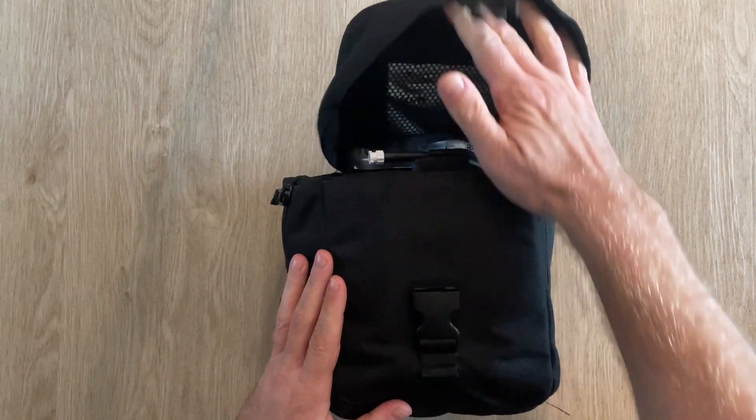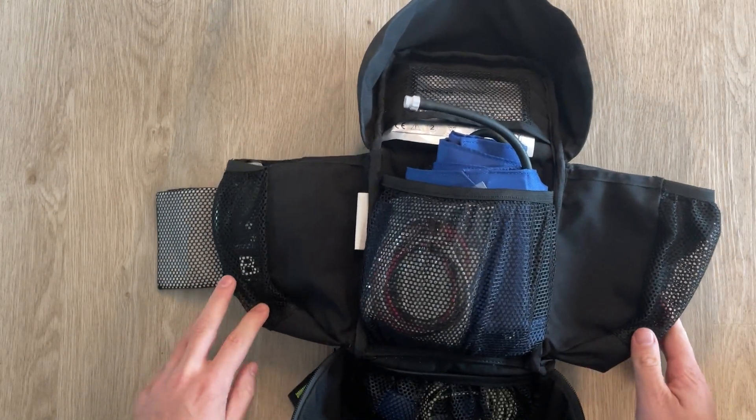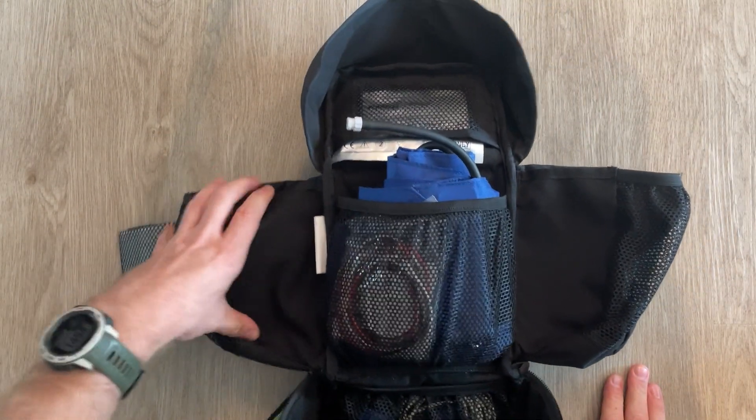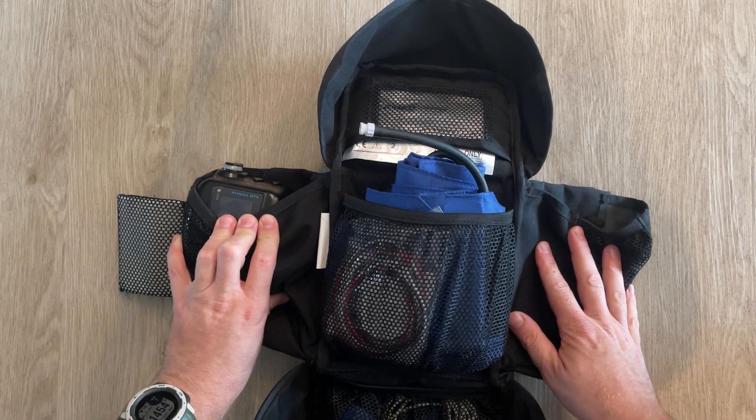Open it up and you get a couple of zippers — the whole thing just flakes open like that. You've got one WVSM that can go in here, and you can put another one in here if you like; it's meant to carry two.